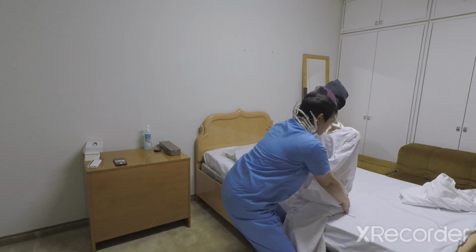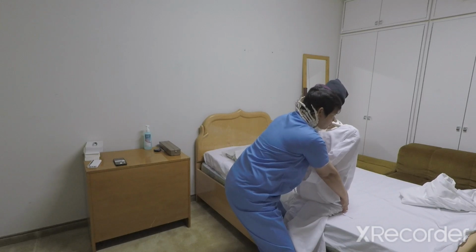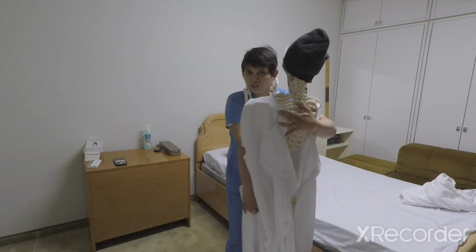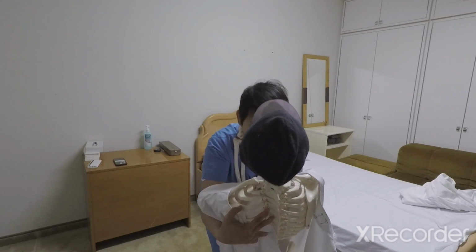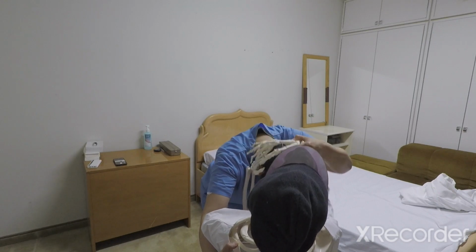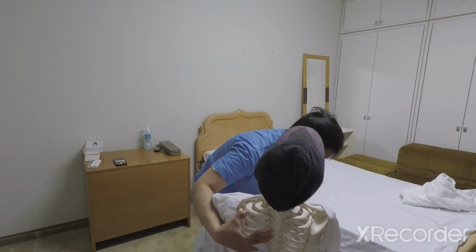Hold the patient on the pelvis. Support the back. Then, ask her to move on a count of 3. 1, 2, 3. Then, tilt slowly, then transfer to the chair. Okay, now you can proceed to removing the hand. That's transferring a patient from bed to chair.